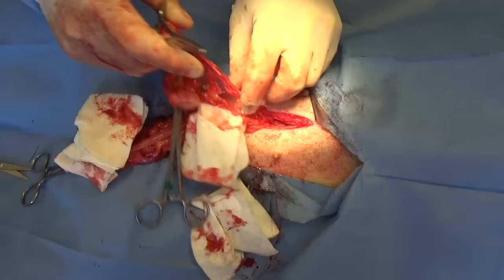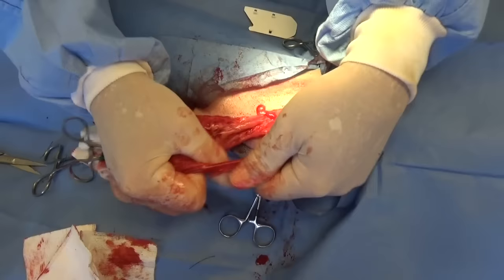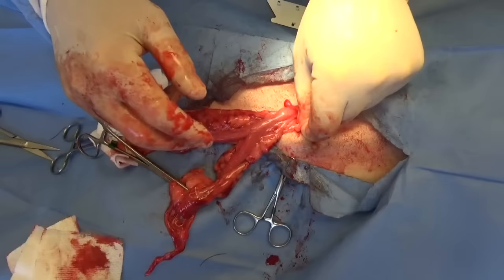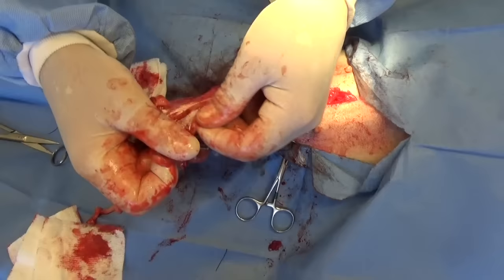And then I'm going to take this. This is the broad ligament. Just look at how broad it is. And sometimes we tie it off and sometimes we just kind of pull it apart. It's got very tiny vessels in it. And you might see a little bleeding, but it'll stop immediately. And you just kind of see how window-like it is? Look at how window-like it is.